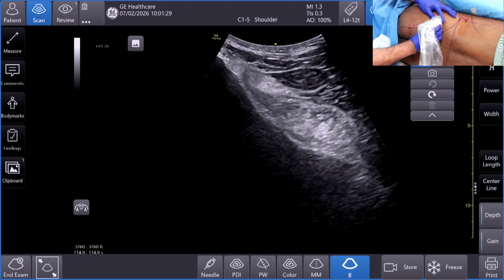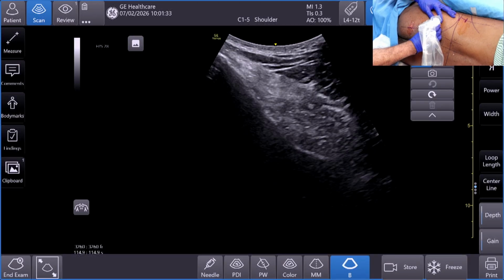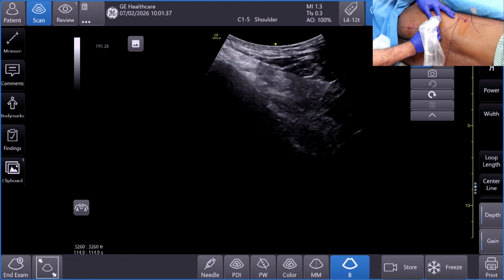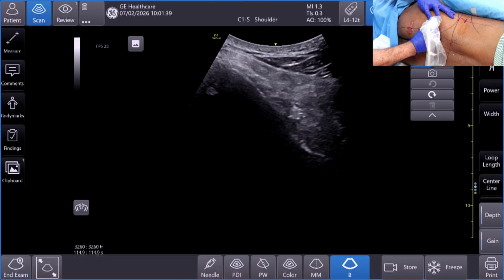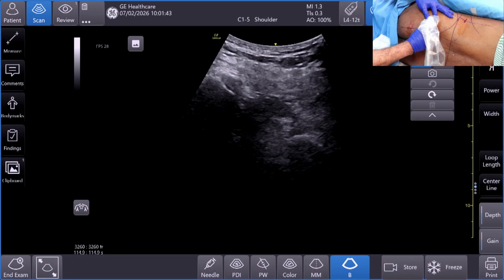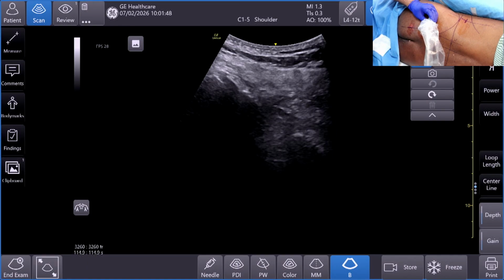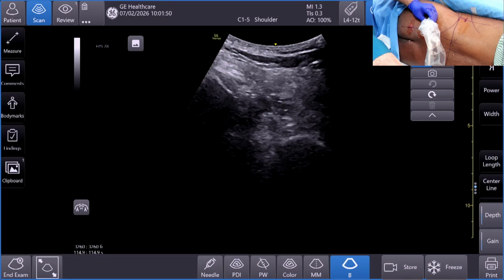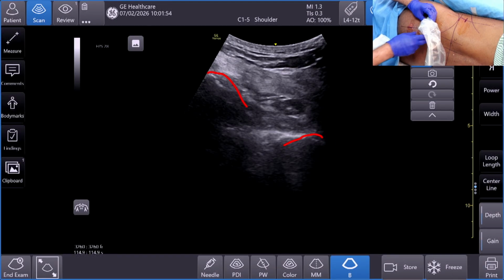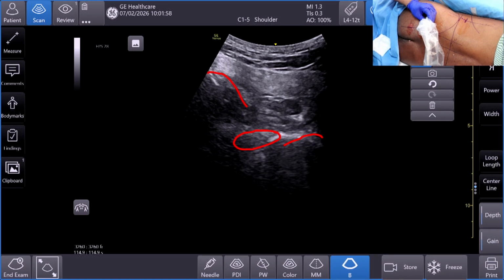I am going a bit more caudal along the line we have drawn, a bit cranial to it, and you have to see the break in the continuity of the iliac bone, which is usually observed at this point. You can now see the discontinuity of the iliac bone, and here would be the other part of the posterior border of the ischium and the ilium, and the sacral plexus would generally lie at this point.